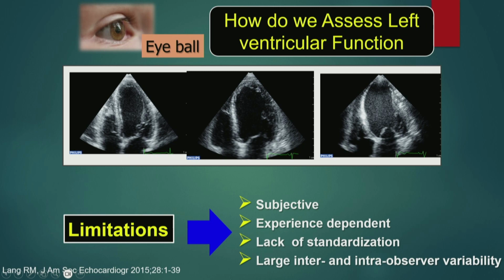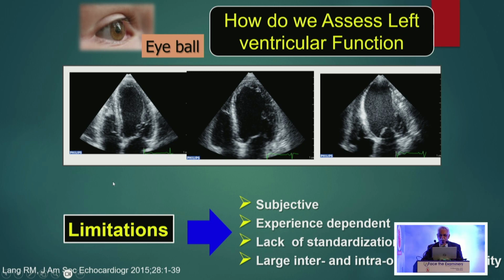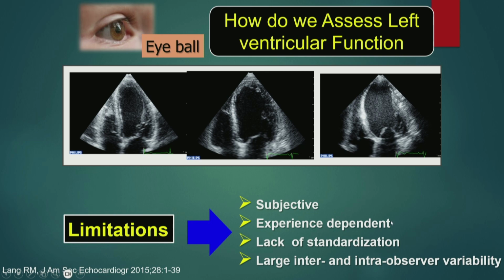And most of you will be asking, how about an eyeballing method? The eyeballing method is subjective. We can do it when you are in a hurry like this, when the ejection fraction is completely normal, when the contraction is completely normal.